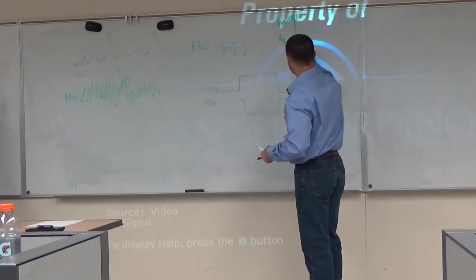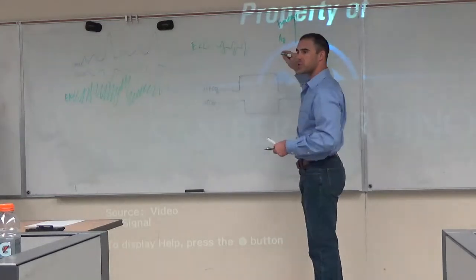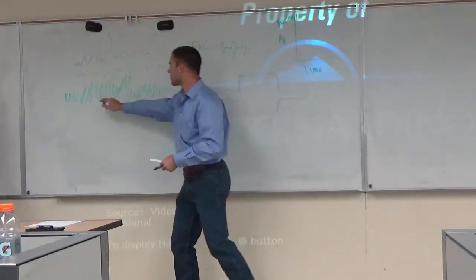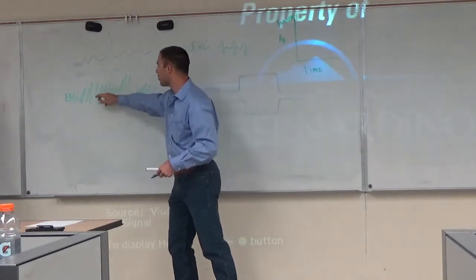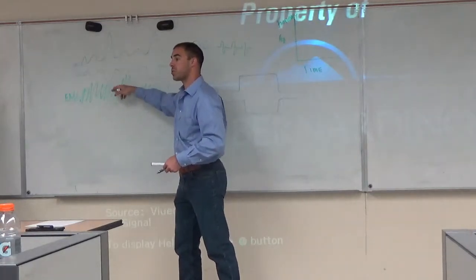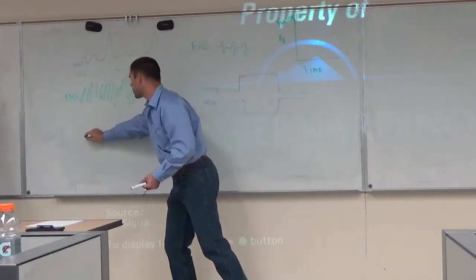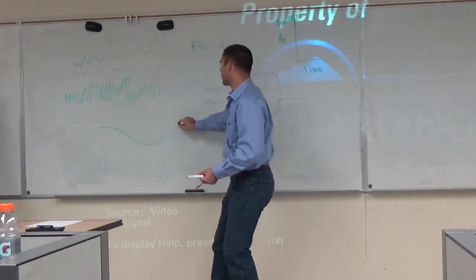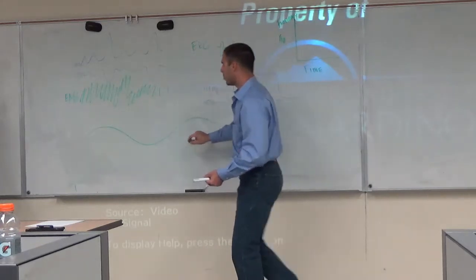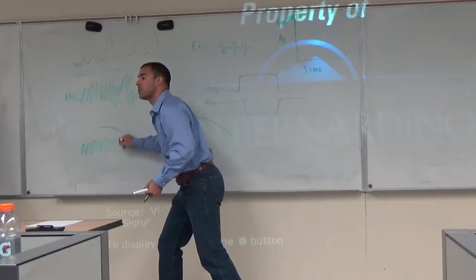Just like any y-axis, you're going to have different values. And so we can start to characterize the frequency, which is how fast or slow a particular wave takes to recycle, if you go from start to finish, a sine wave. It can be a very slow wave, like that, or it can be a very fast wave, where it cycles back lots of times.